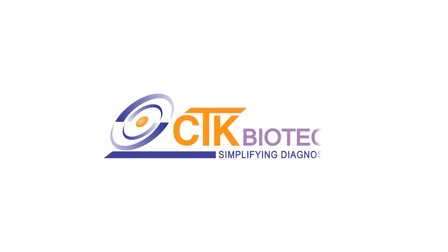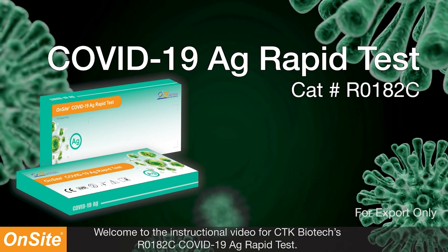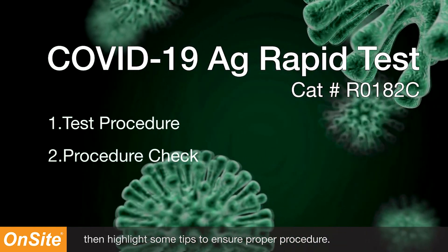Welcome to the instruction video for CTK Biotech's R0182C COVID-19 Antigen Rapid Test. Today we will go over the test procedure and highlight some tips to ensure proper procedure.